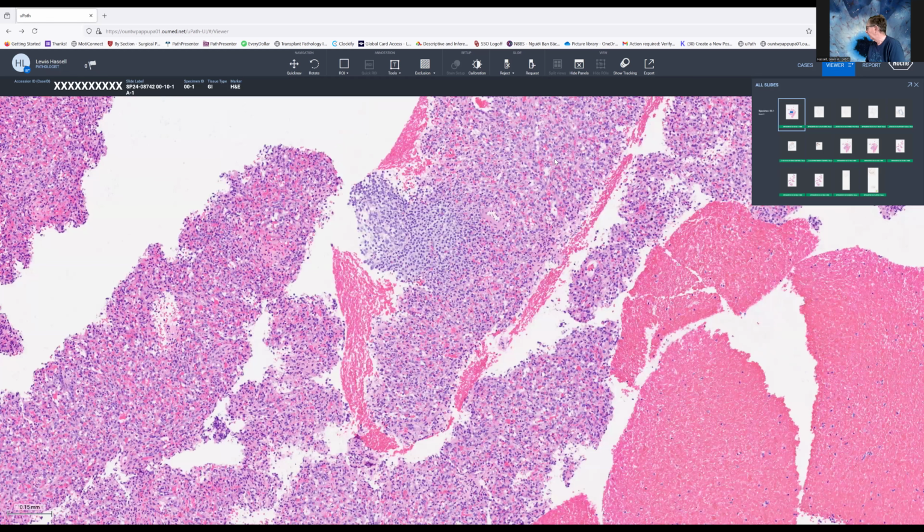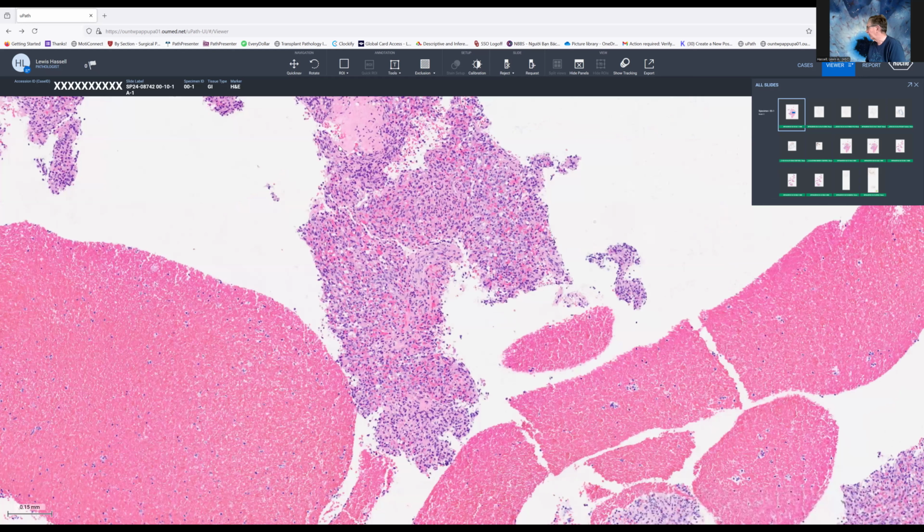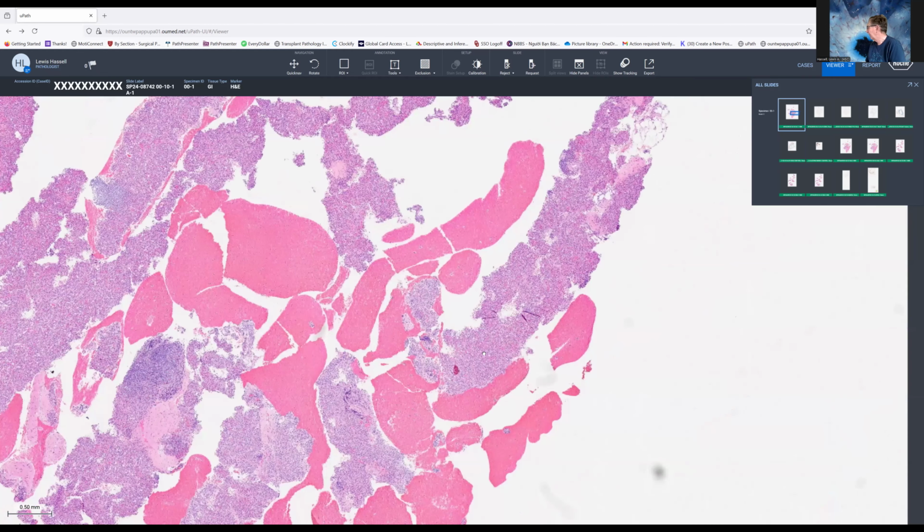There are a few other larger vessels, but throughout this biopsy, although intended to be a sample of hepatic parenchyma, we see only tumor tissue. So clearly this is the lesion or the area that was considered to be the source of this process.